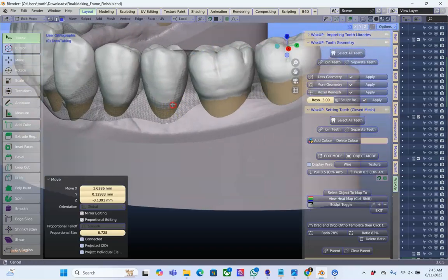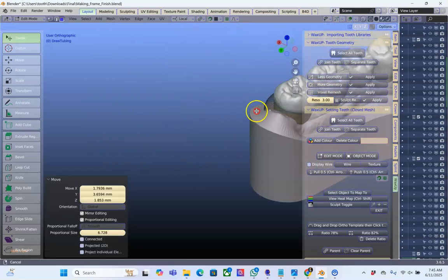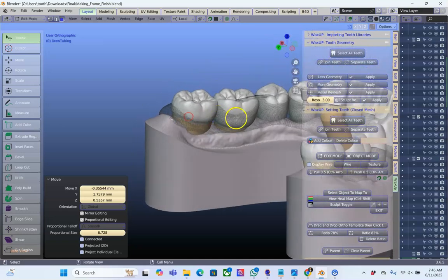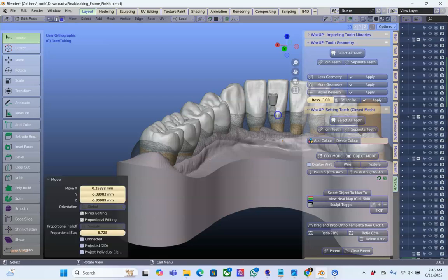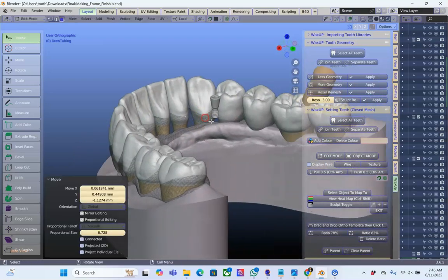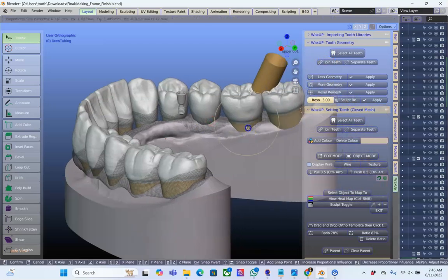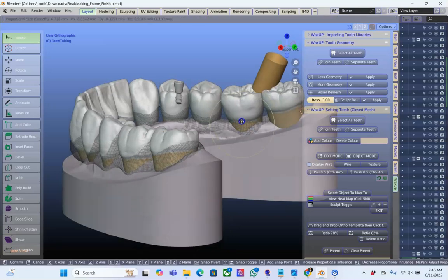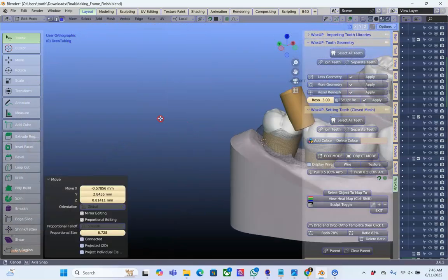So all I'm doing is I'm just selecting some mesh and then using the G key on the keyboard to bring it out where I need it to go. Very, very simple to do. It's actually quite fun. Bring that down like that. You don't always have to use the G key, you can just drag it as well. As long as this one is on tweak, then you can just simply drag it. There's a little bit of practice. So that's looking quite good.